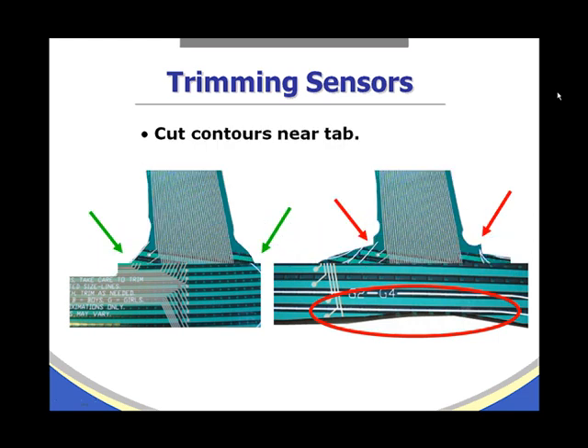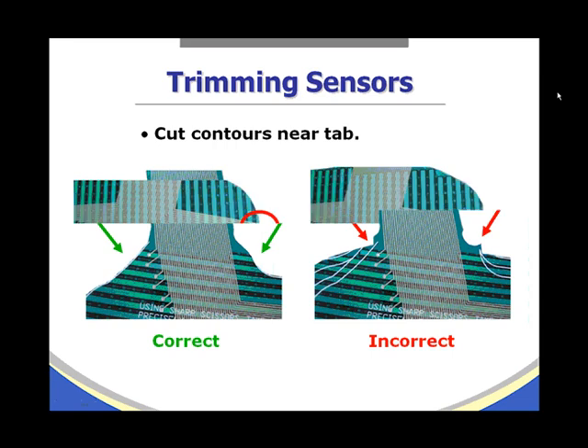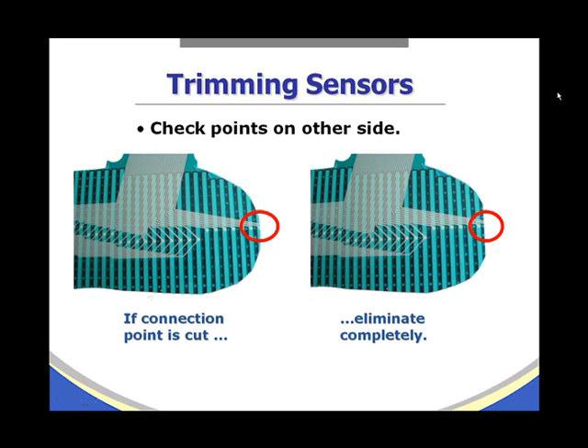When cutting near the contours or near the tabs, make a contour cut, which will minimize the sensor's ability to rip or tear. After trimming, flip the sensor over and check the connection points on the other side to see if any have been cut through. If a connection point is cut through, trim it completely away so it is a clean cut and the outermost element is completely whole and undisturbed.